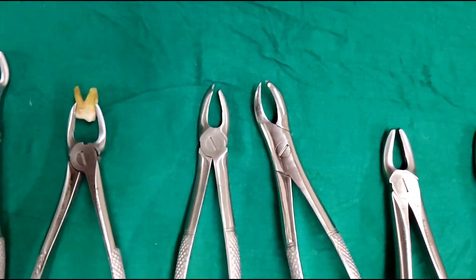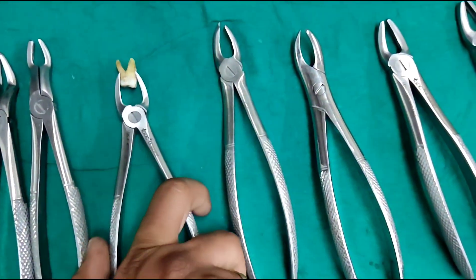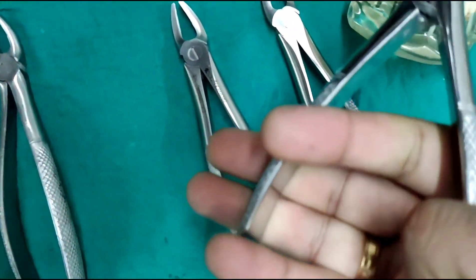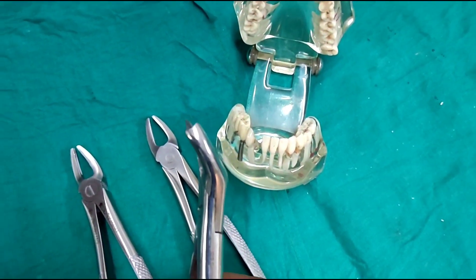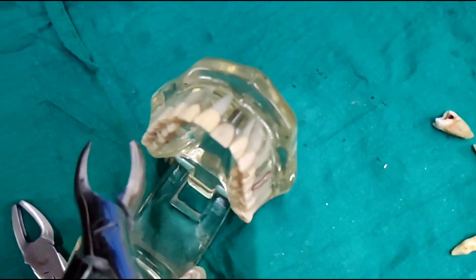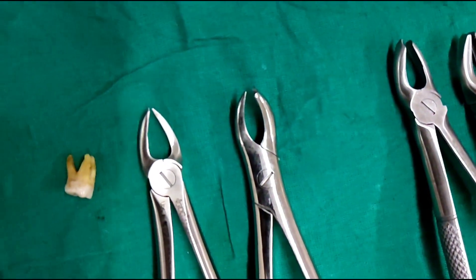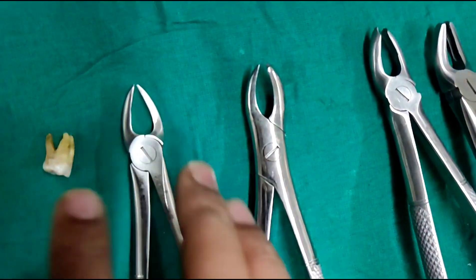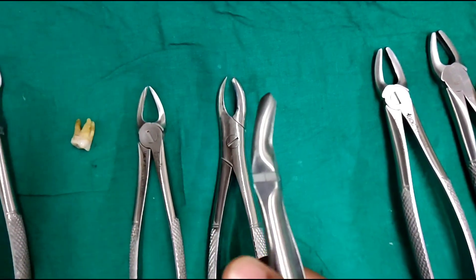Coming to the types of molar forceps — this is the extraction forceps of the second quadrant. The extraction forceps of the first quadrant looks exactly opposite: the cow horn type beak is on the opposite side, so it engages into the furcation area of the buccal roots, whereas the wider end of the beak engages the palatal root. This is the molar forceps of the first quadrant. You can see the difference between the molar forceps of the first quadrant and the second quadrant here.